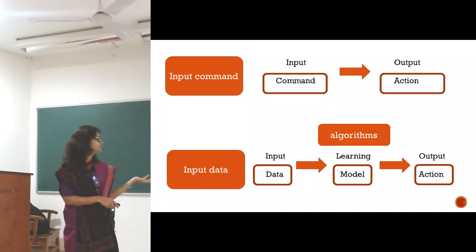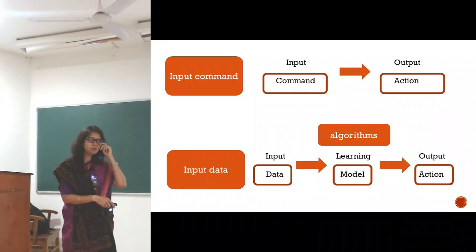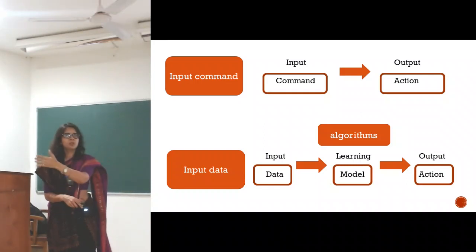What we were earlier doing is just doing morphometry on the digitized images. But with computation, we are using algorithms where we are not telling the computer what to do. The computer is learning and working like a human and giving you the output. When you are giving the computer the problem, he wants to know what is a better tumor.